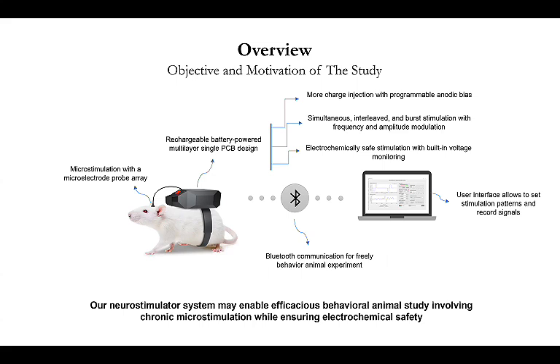We call it the anodic bias applying voltage. And then we should also have voltage monitoring: we will inject the charge injection signal through the electrodes, but at the same time we should monitor the signal response. So we added all these features to solve all the 5 challenges.